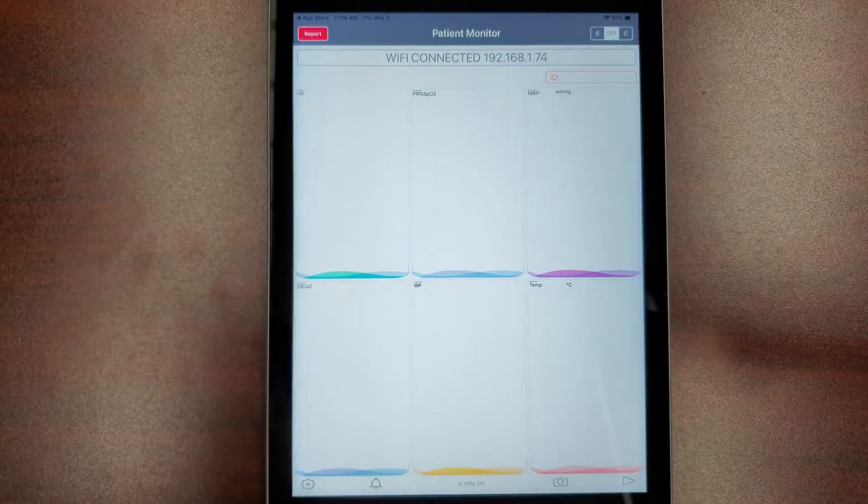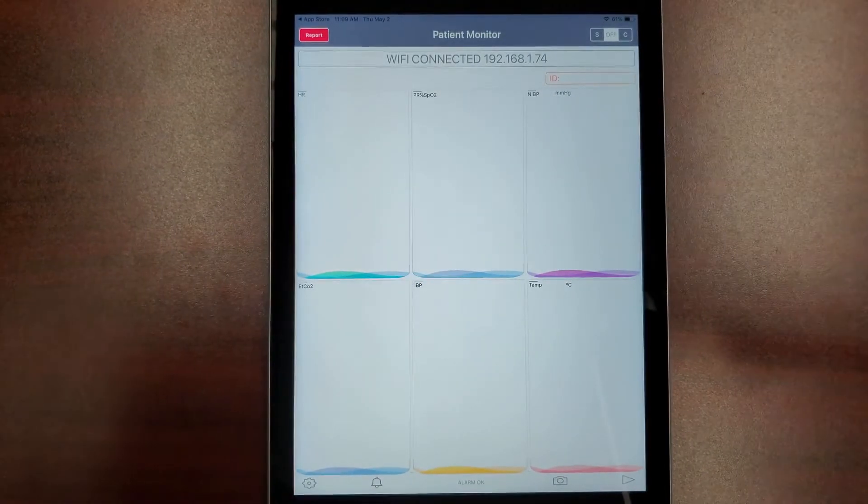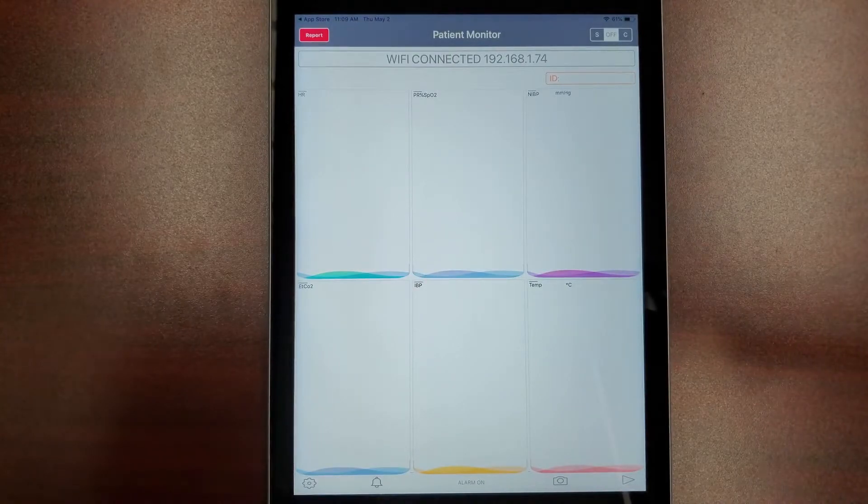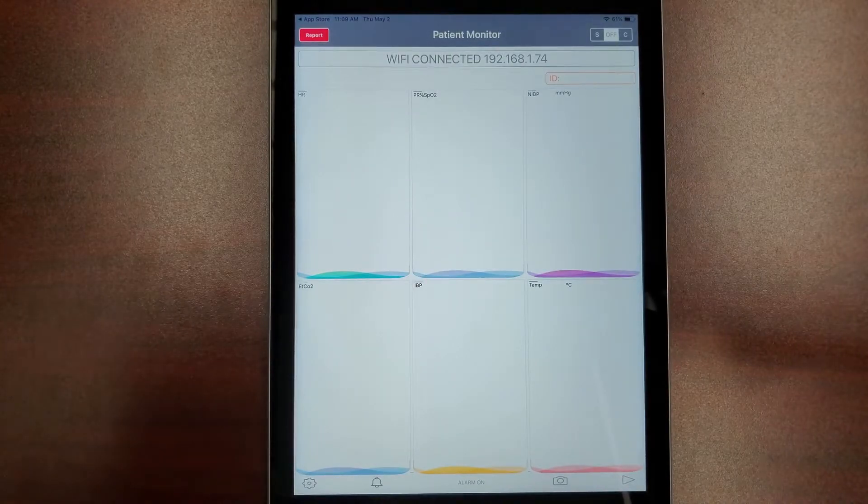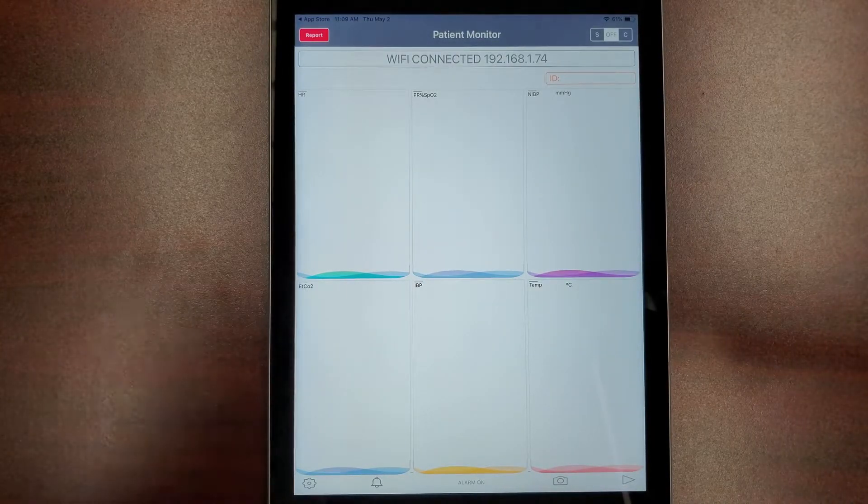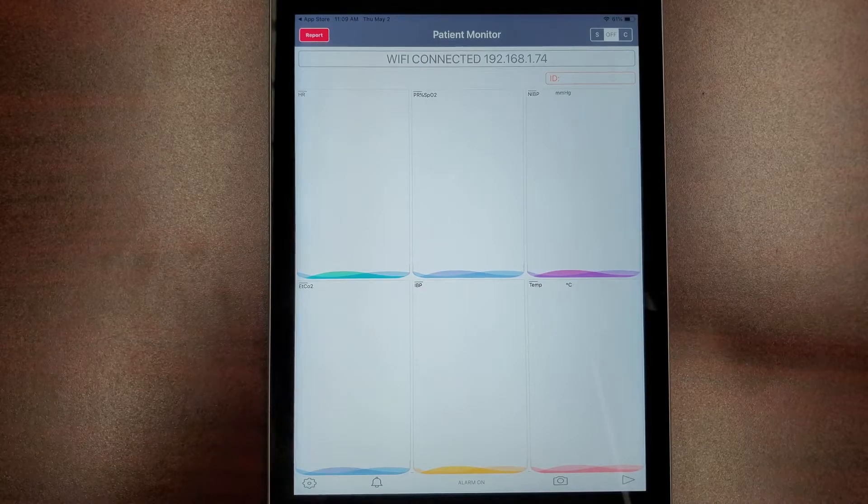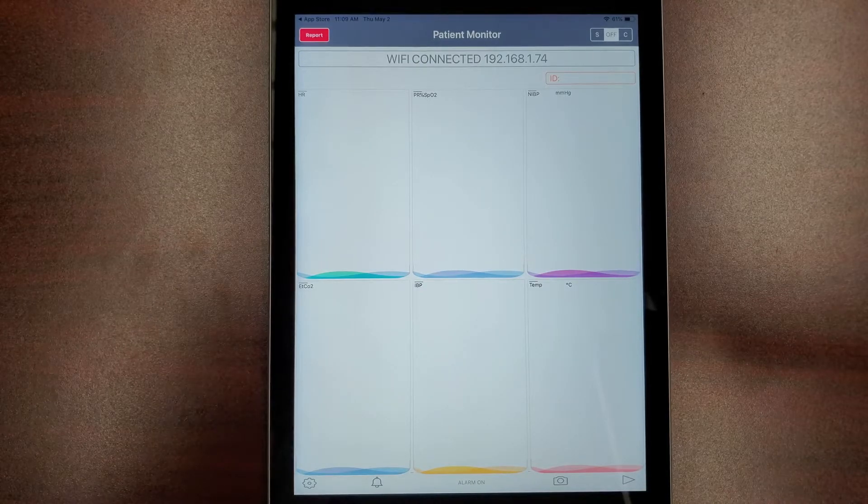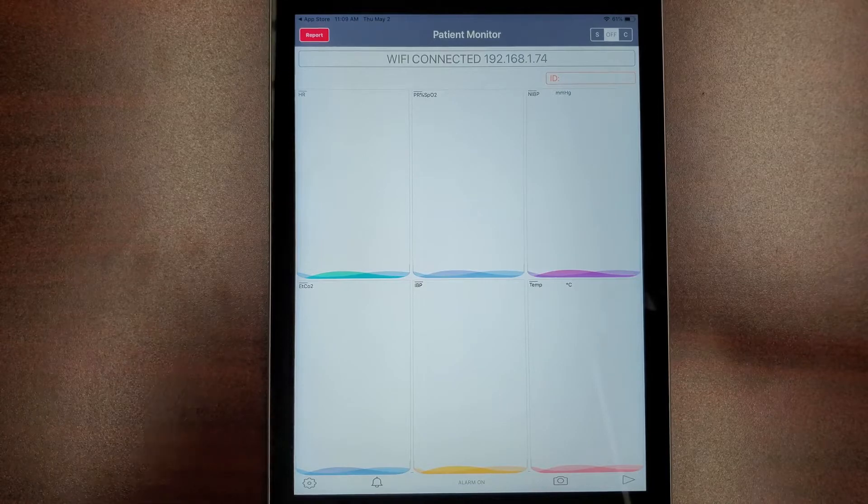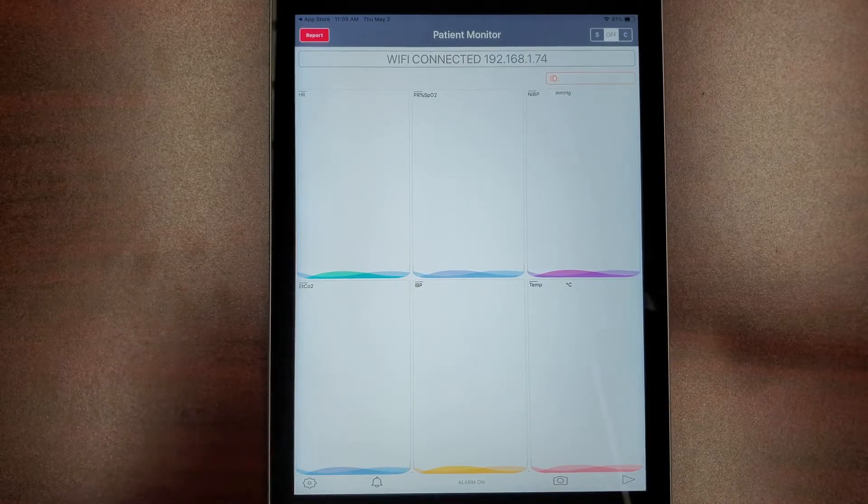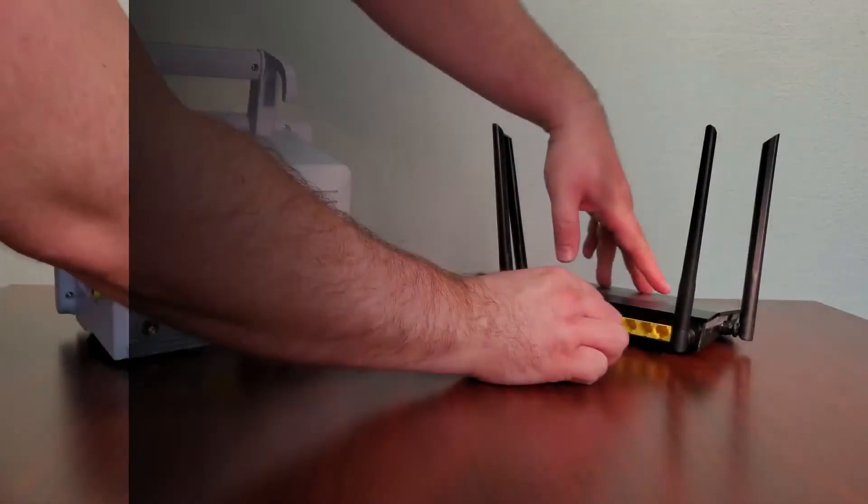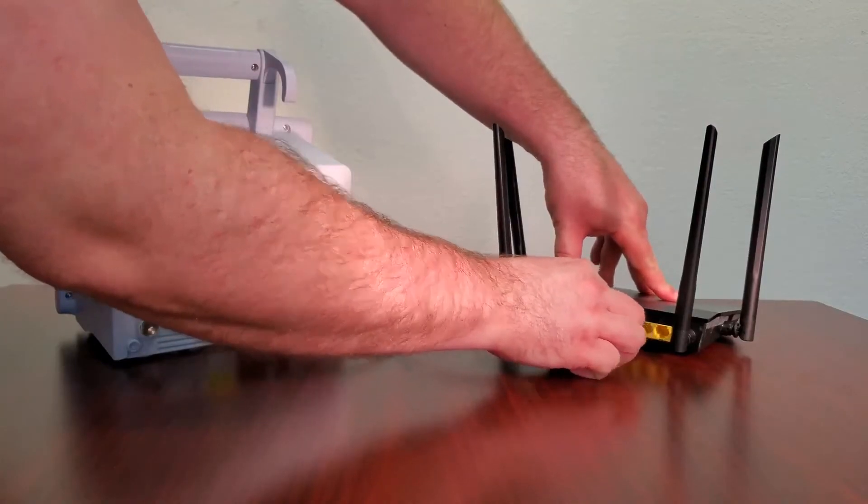The next step is to ensure that your patient monitor is properly connected to send the patient data. Connect your patient monitor to the same internet router your mobile device is connected to over Wi-Fi. Both the patient monitor and the mobile app must be on the same network to send data. You must connect your monitor to the router by using an ethernet cable.